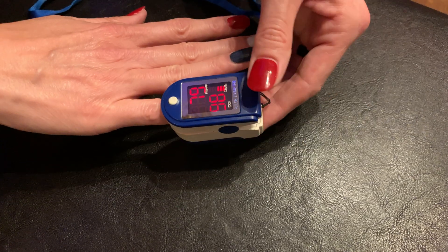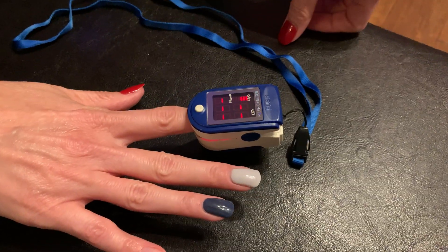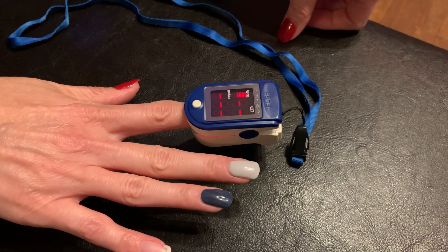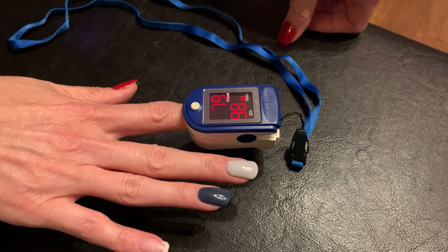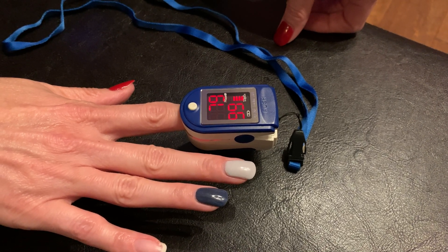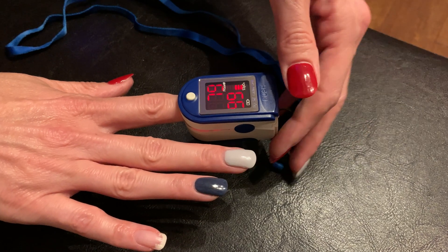Now she's going to switch it to the red, which I would think would not read as well. I'm seeing a pulse reading — a little bit of a glitch there — it is having a little bit of a problem, but I'm reading 98 with a pulse rate of 80, then 99. So it seems to work even through the red, which is the one color I expected it wouldn't.